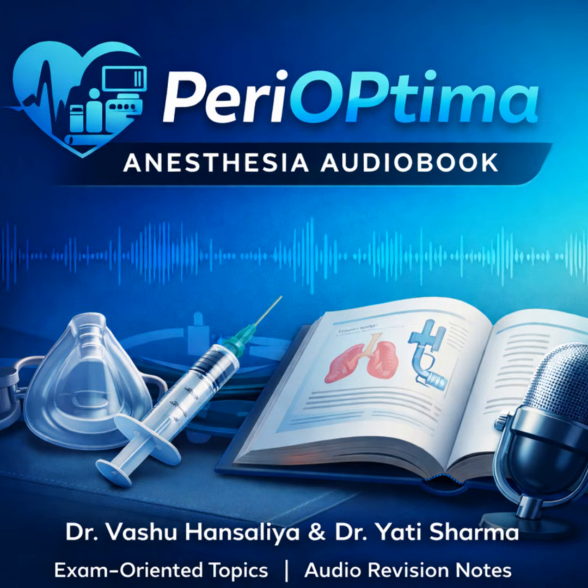Let's get into the different types of video laryngoscopes, starting with how you get the tube in. This is a crucial distinction. First, you have channeled VLs like the Airtraq. They have an integrated guide tunnel built right into the device. So it's a bit like a point and shoot.